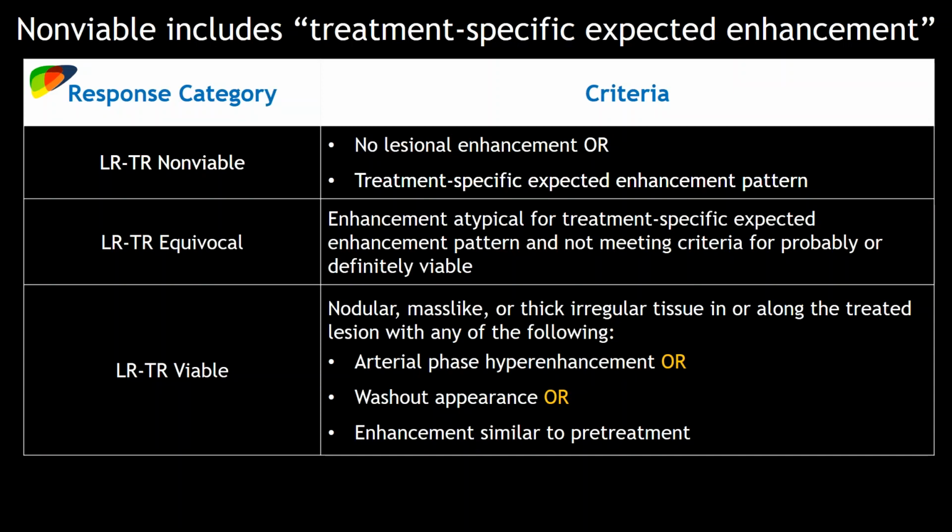Now, I think what you can do sometimes in your own practice is that if you're using LI-RADS and the strict application of the algorithm is equivocal, then you would say that.